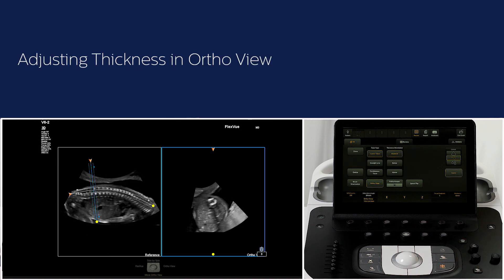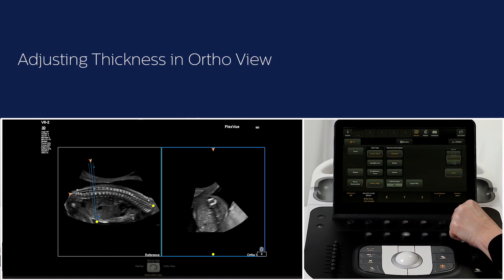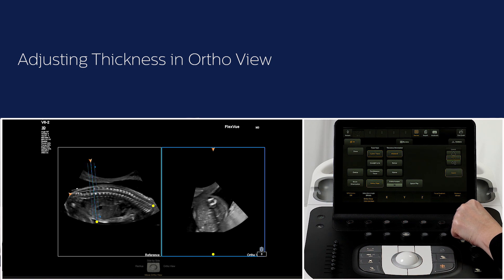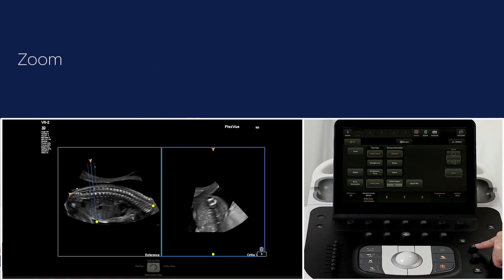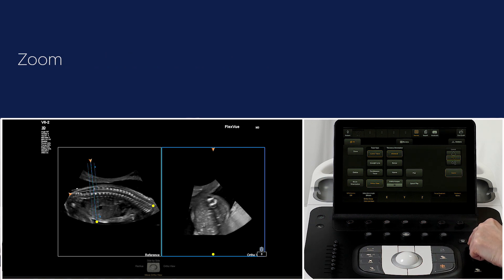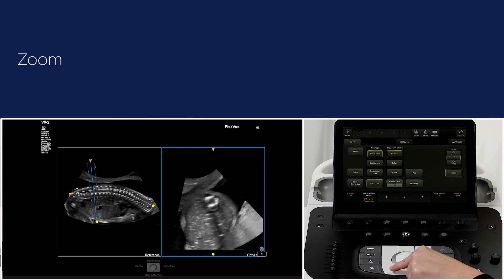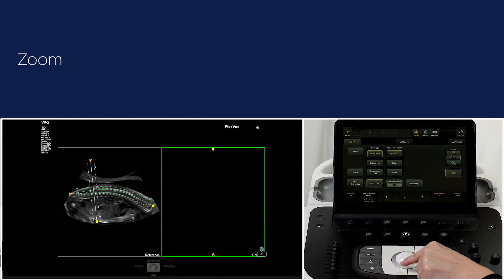When you turn the thickness rotary knob now, notice that the FlexView and the ortho view trace line thickness adjust together. You can zoom the ortho view by turning the zoom knob, then change to the FlexView image and zoom if needed.